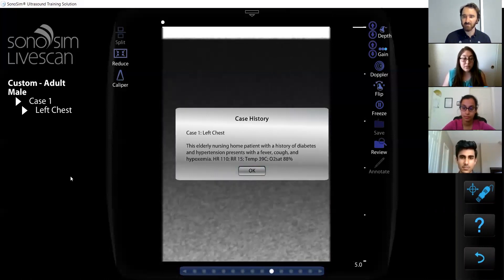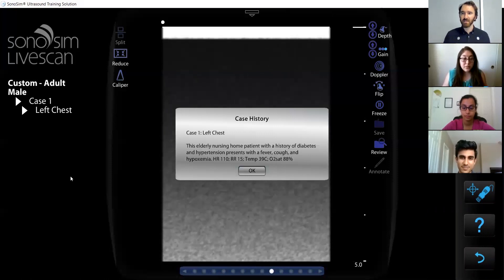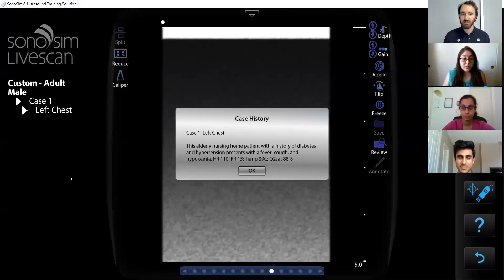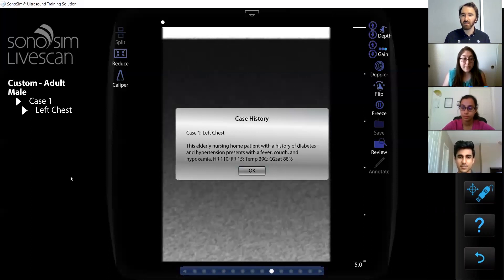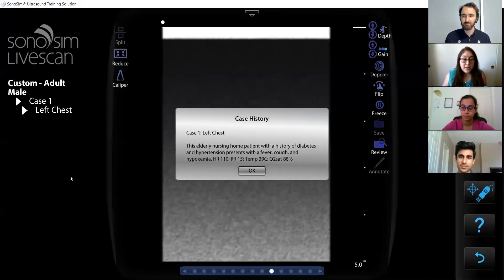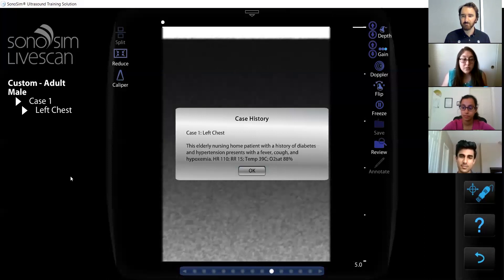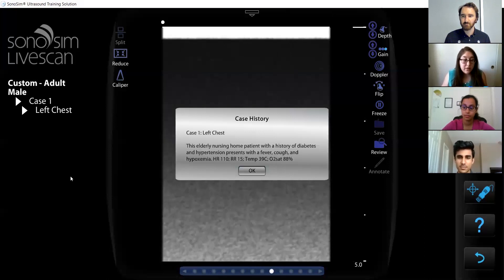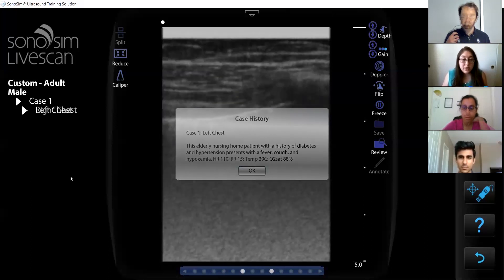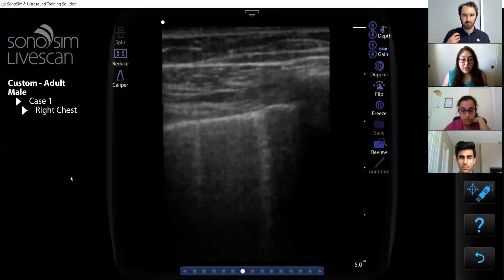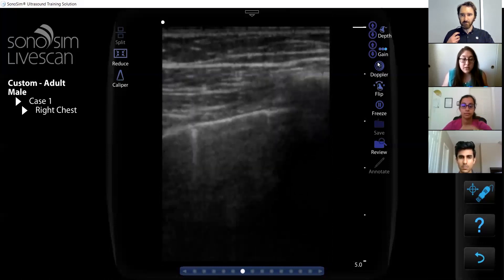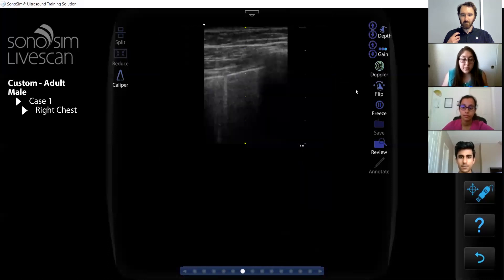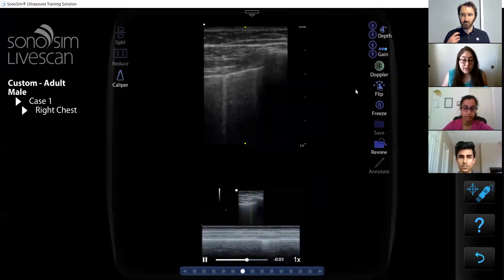You can see the vitals right there. I'm just going to ask you to tell me where to scan. I have the SonaSim LiveScan tags on me, so I'm going to be scanning myself. Let's start with Jess — can you go ahead and tell me where you want me to scan? Given that this patient has a cough, can we start with the lungs? Let's start with imaging the right lung. We're seeing multiple B-lines here. Can we use M-mode to confirm lung sliding? It looks like positive lung sliding.